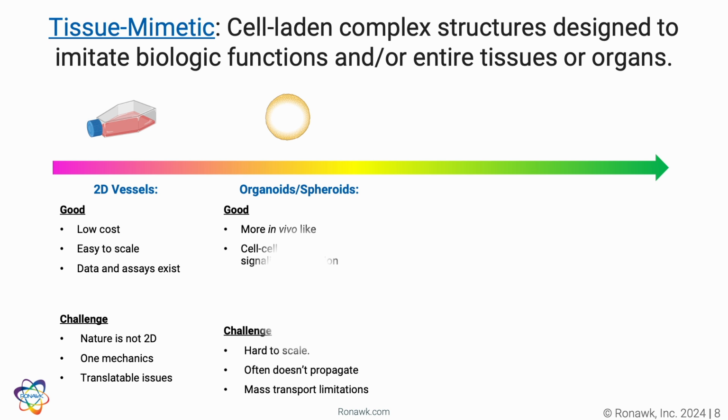Other tissue culture systems like organoids and spheroids are great, and I think that the research that we have come to in the last 10 years with the introduction of organoids and spheroids and the need for three-dimensionality in culture systems has been amazing, because we were able to see more in vivo-like structures, those cell-to-cell interactions, the importance of the microenvironment that the cells form there, the importance of matrices, why the cells are producing so much ECM when they're developing new organs and stuff like that.